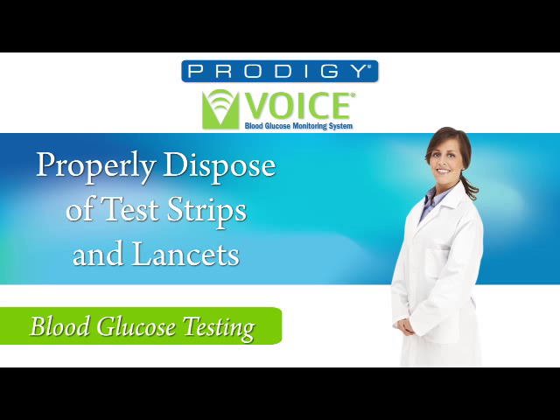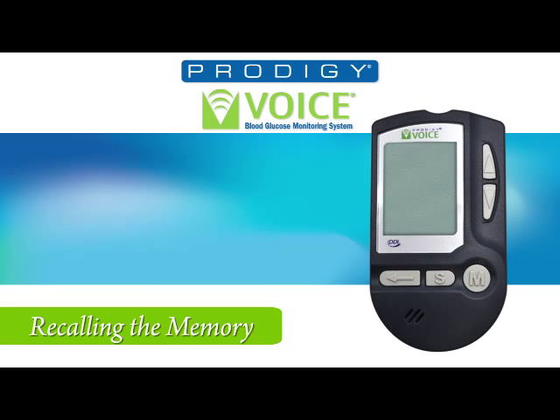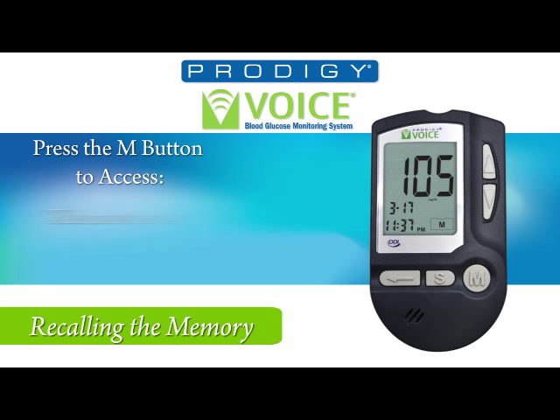Discard the test strip and the lancet according to local regulations. To recall test results, press the M button while the meter is off. You will hear: 'Your Prodigy Meter is on. Today's date, March 17, 2011. The time, 11:37 PM.' Press the M button again to view the most recent reading first. Press the up or down buttons to move to the next or previous test result. The meter will display a number on the screen indicating each result in memory.